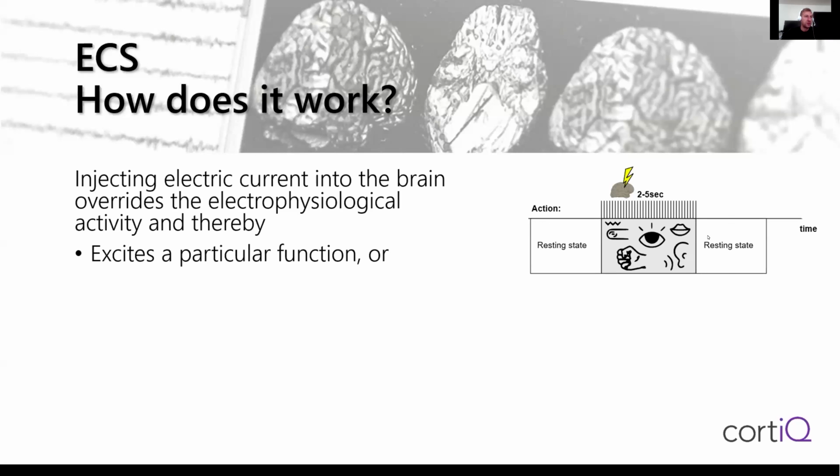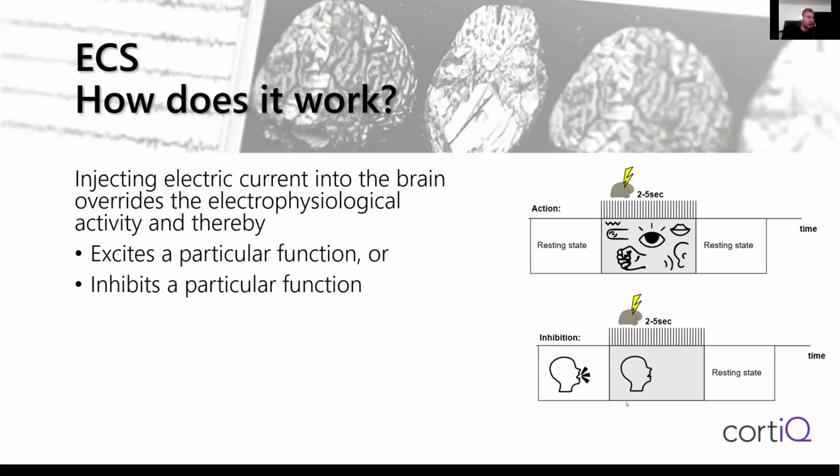And then after the stimulation, this state reverts to the resting, and the symptom is gone. And then we know that the symptom that the patient experienced is only caused by the electrical stimulation, and now we can assign this functional category based on the stimulation symptom.